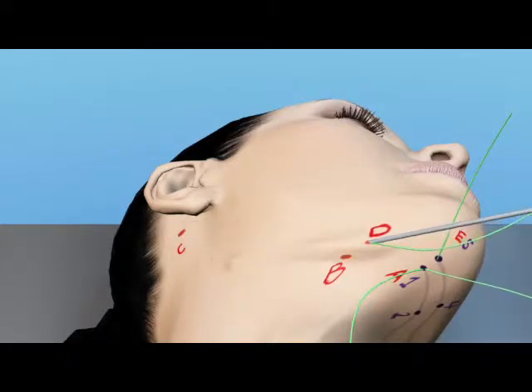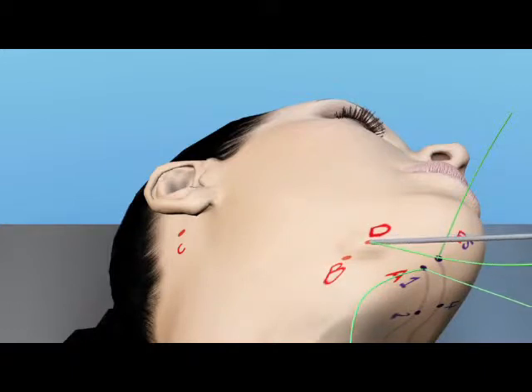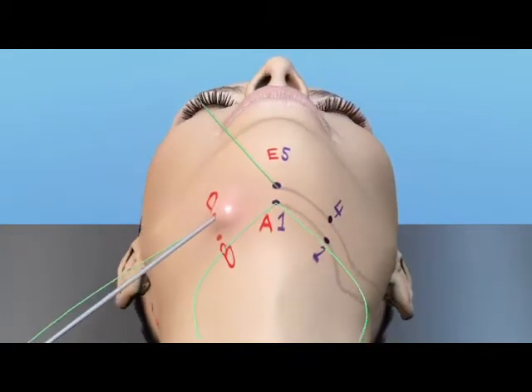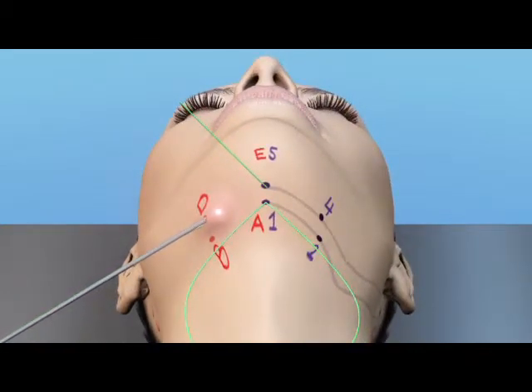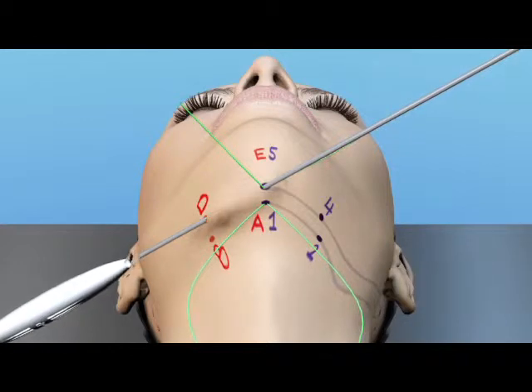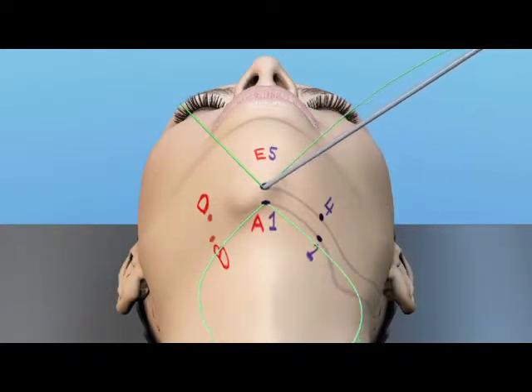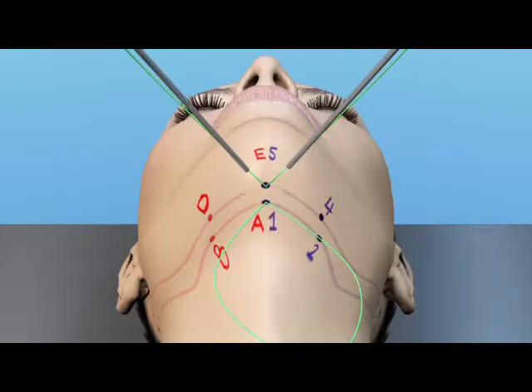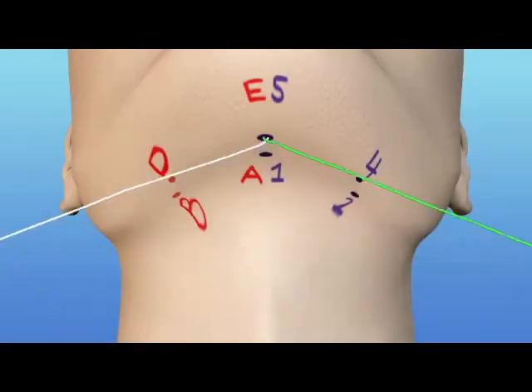Rod is then brought out through point D. It will then be pivoted, leaving the tip of the rod in the subcutaneous space, and the rod will be brought out through point E5. Of note, the sutures are not cut at this point. Suture rods are left intact and the sutures are tied together. And then the matrix is carried on anteriorly to place the trampoline platysmoplasty.